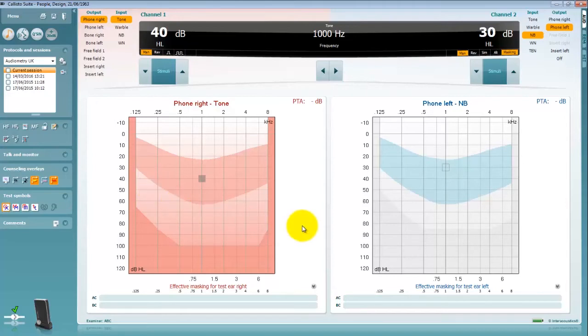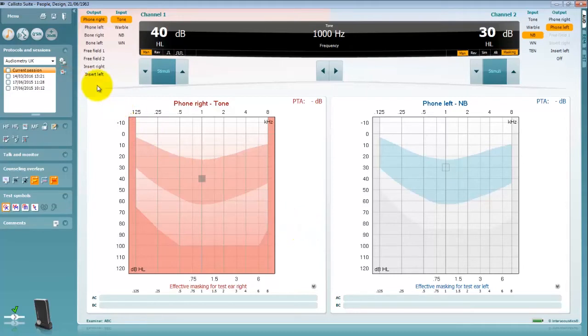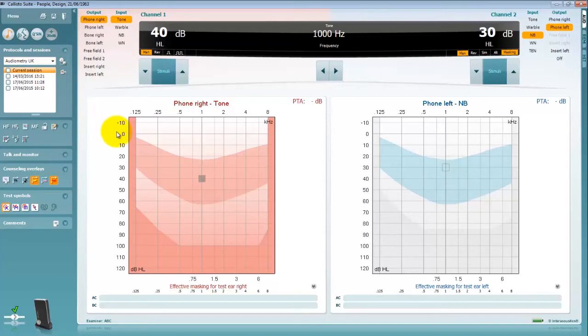Once a suite has opened you can choose your test protocol via this drop down. It is likely that this has been created in advance of you using your software by your audiology administrator or training lead.